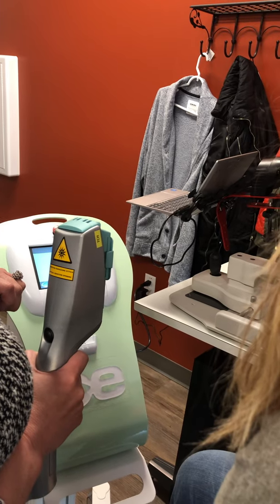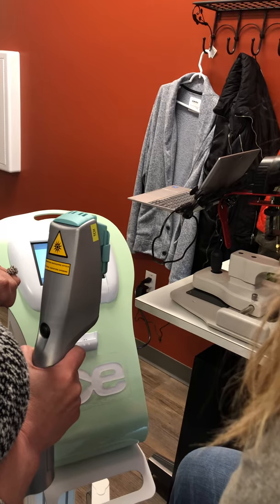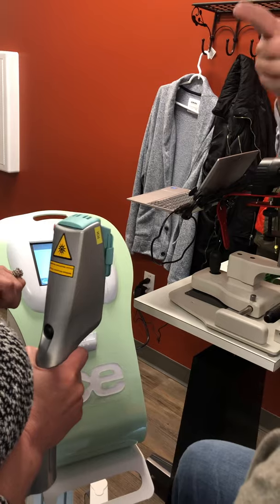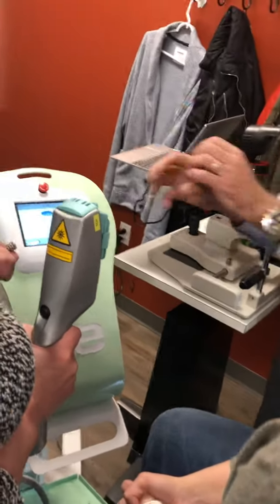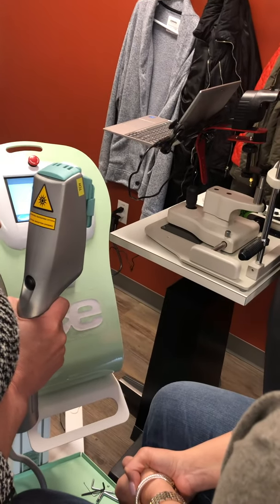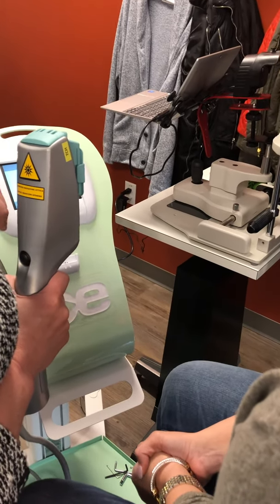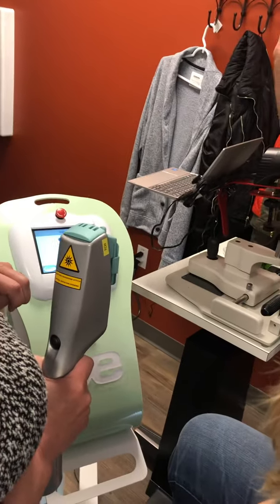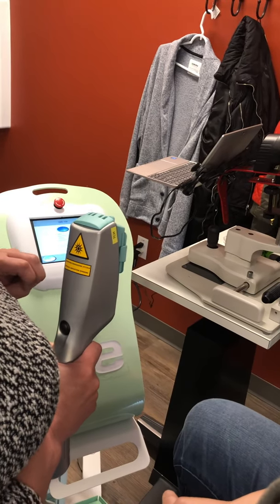So we'll put our first treatment 1, 2, 3, 4, 5, but then I'm going to come down in somebody like you and go 6, 7, 8. Kind of get that whole cheekbone, because what I want to do is get that Demodex in control. Oh, that's all in one shebang. And that would all be in one shebang. So I'm going to look at you and say, I'm not doing just 10, I'm going to do at least 14. My point is that if you stop at 10 and then go do another 4, now you just did 2 treatments. Each treatment's going to cost you a little bit less than $5. Okay? We good?